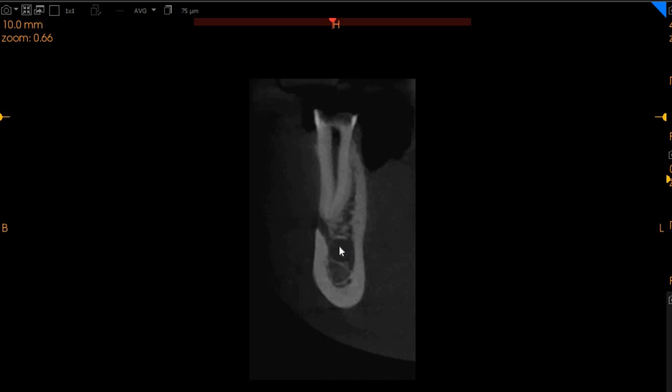nerve. Now, the thing to be very mindful of during endodontic treatment or during extraction is that no extrusion of materials, no extrusion of instruments should be attempted, because it is going to directly affect the mental nerve in this case. The estimated working length for this patient, I'm going to keep slightly conservative, is going to be 18 millimeters, or 17.5 to be more precise in this case.